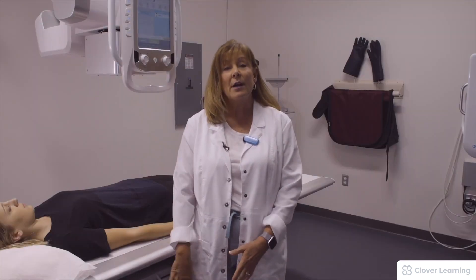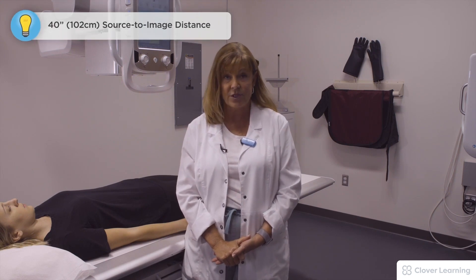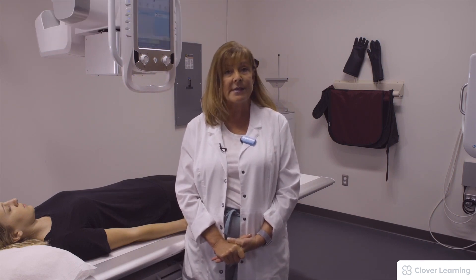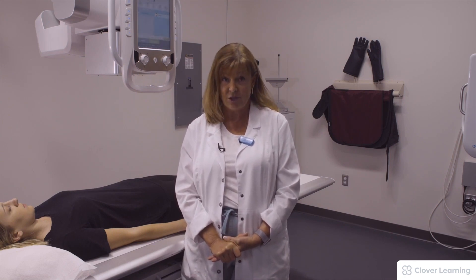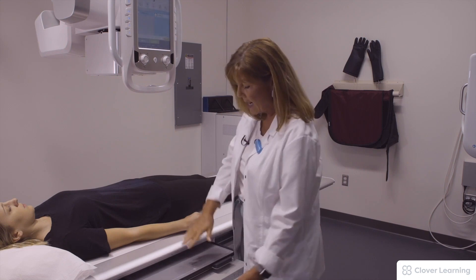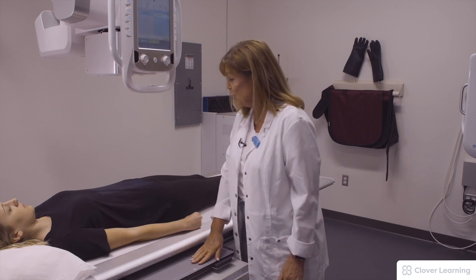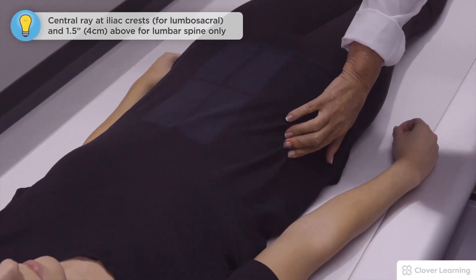I am starting with the IR in the bucky tray, so you will need to make sure that all of your locks are engaged. I am also choosing not to shield on this particular exam because it would obscure diagnostic information. We're going to start with the IR in the bucky tray and I am going to center at the crest.